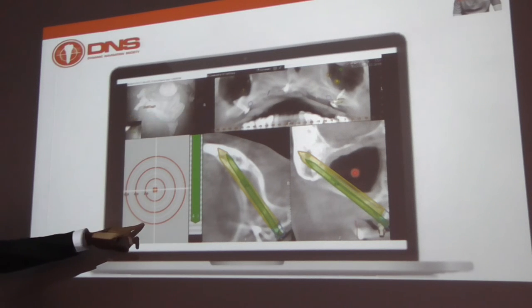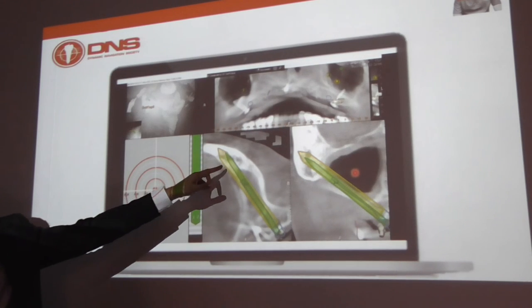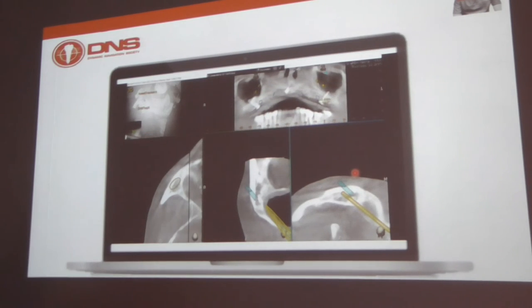This is the normal target, huh? Yes, this is 3 mm. 3 mm. And the points are these yellow ones that show up. This? No, on the panorama? No, that's his concern. That's my planning. Those are the points.